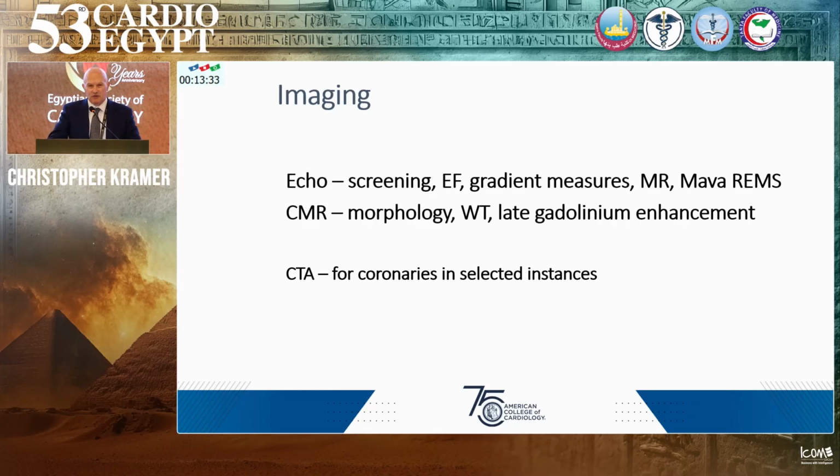Echo is useful for screening, identifying the disease, measuring the ejection fraction, the gradient in the outflow tract in obstructive HCM, assessing mitral regurgitation, and we use it all the time now to assess the safety of mavacamten and now soon to be aficamten, the new cardiac myosin inhibitors.